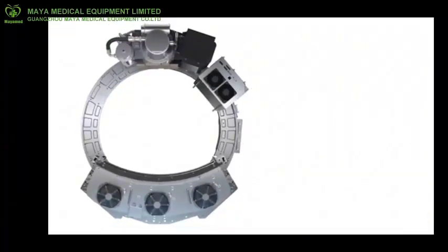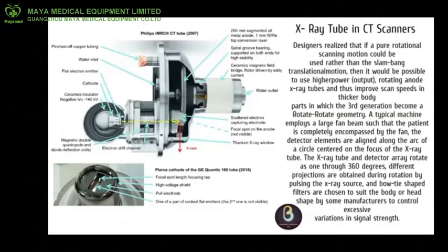Tungsten, with an atomic number of 74, is often used for the anode target material because it produces a higher intensity X-ray beam. This is because the intensity of X-ray production is approximately proportional to the atomic number of the target material. CT scan tubes often contain more than one size of focal spot. 0.5 and 1 mm are the common sizes of a focal spot.